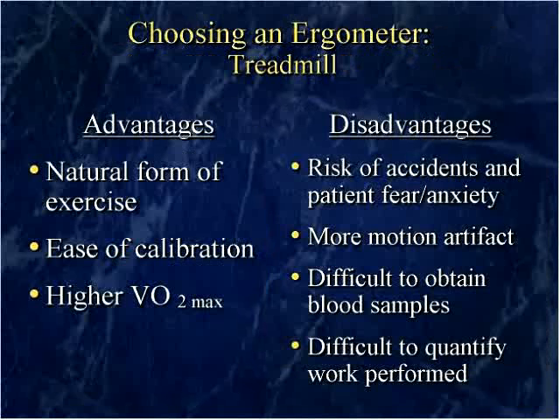Well, what are the advantages and disadvantages of both? Well, the treadmill itself, one advantage is it's a natural form of exercise. Now, that's kind of a funny statement in itself, because if you've ever seen anybody exercise on a treadmill for the first time, half of them don't walk or can't walk correctly on a treadmill. So it's usually a good idea to have some type of small introduction as far as how to walk on a treadmill. Make sure you take a normal stride, that you use a heel to toe approach as far as your placing of your feet, and make sure that they're very natural about it.